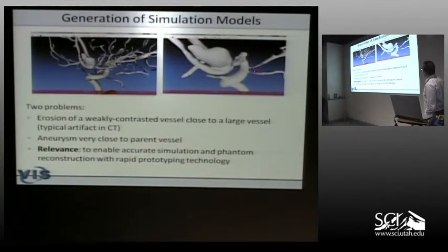If you would take this for granted, then you must think that the person has a stenosis here and there, but this is not true. The signal there is just overshadowed by this large vessel here, so this needs to be corrected. You might imagine that the hemodynamics would be strongly influenced by the narrowness of these vascular structures.